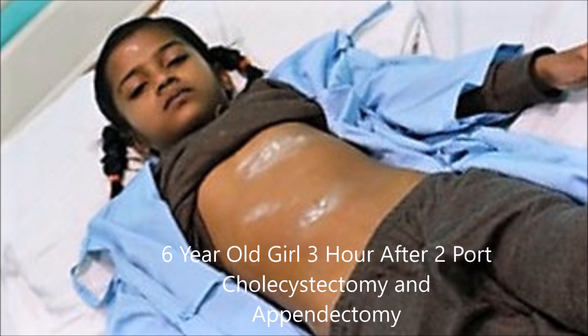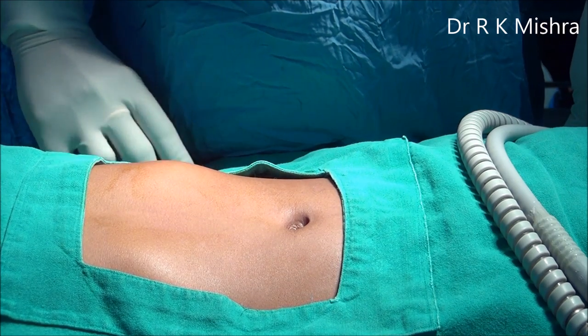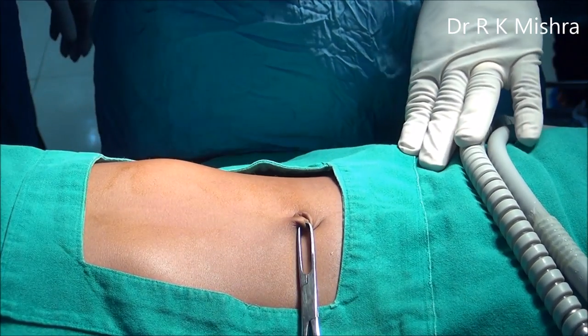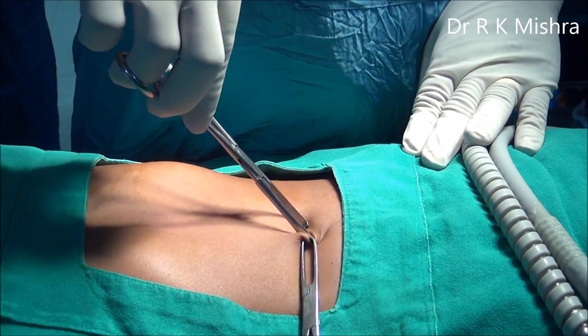This is a six-year-old girl with previous episodes of acute appendicitis and multiple gallstones. We are performing a two-port laparoscopic cholecystectomy and appendicectomy. Two Allis forceps should be applied and the umbilicus has to be everted.